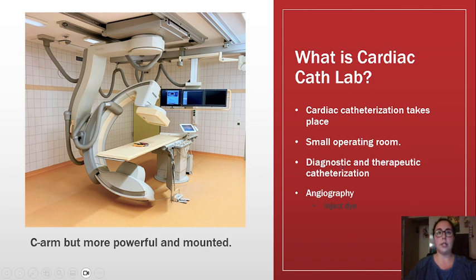The doctor uses the catheter to gain access to the heart and injects dye into the coronary arteries, essentially an angiogram. As people age, the normal blood flow through the arteries can be affected.